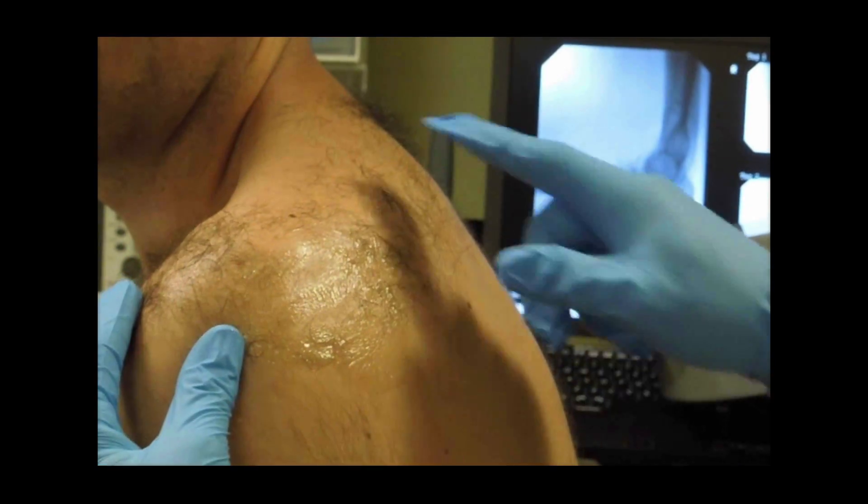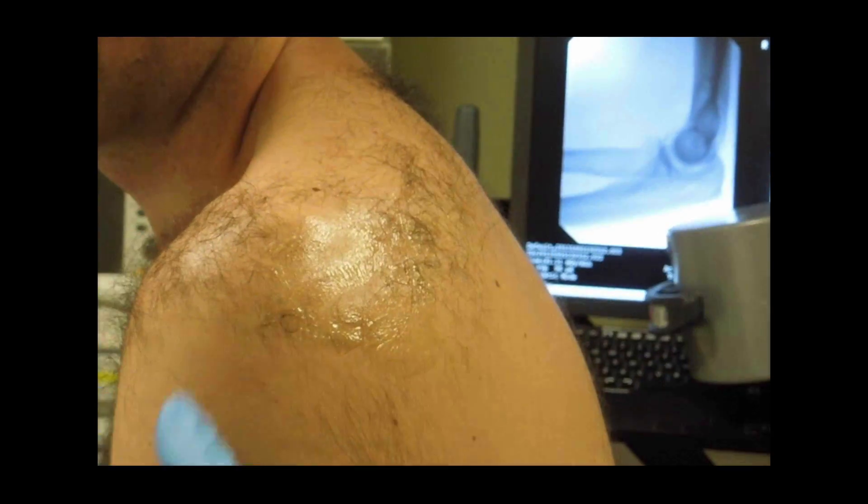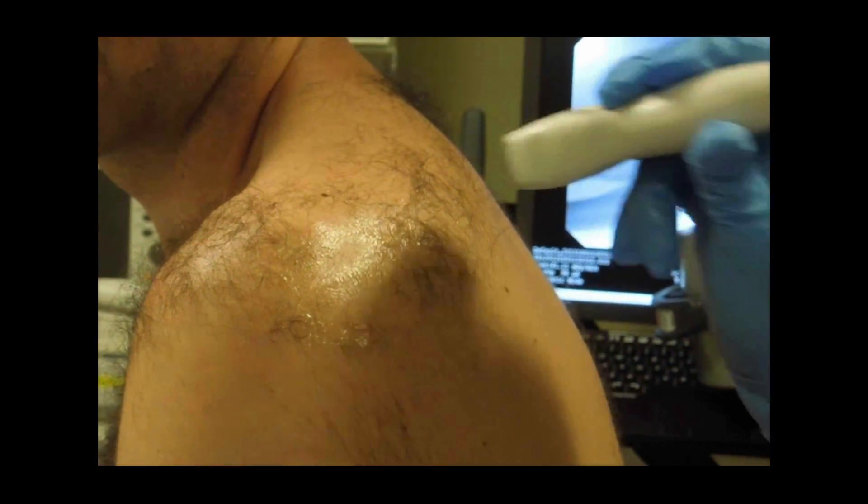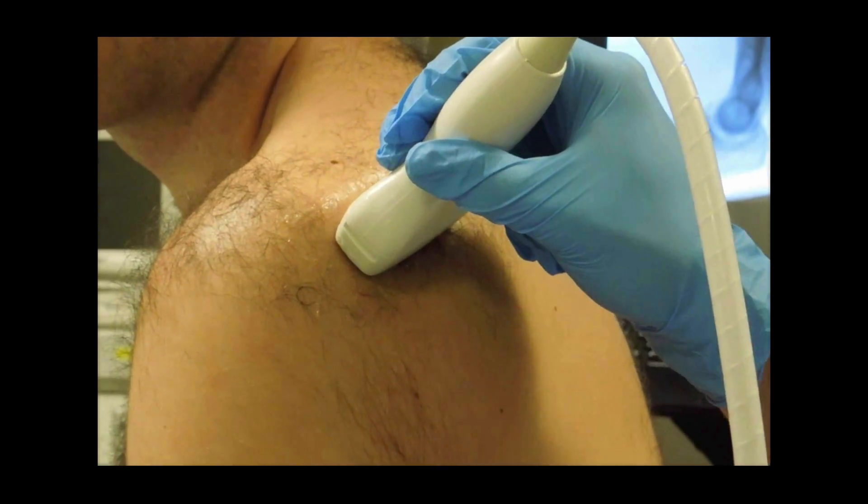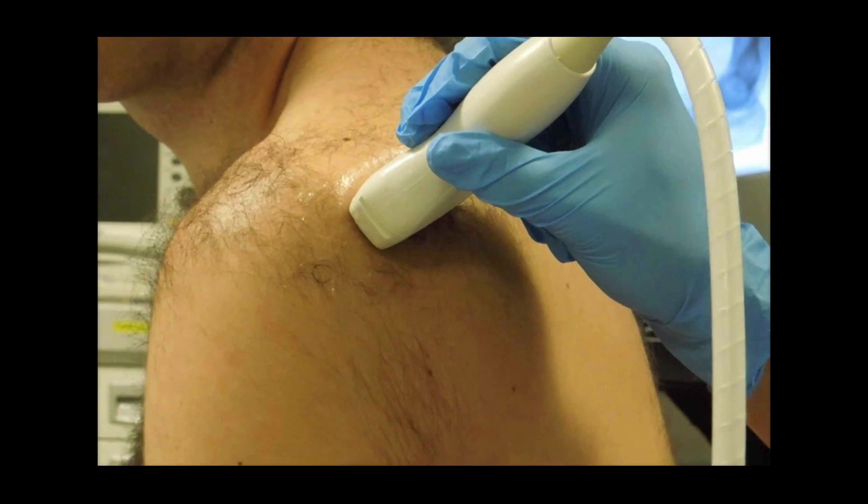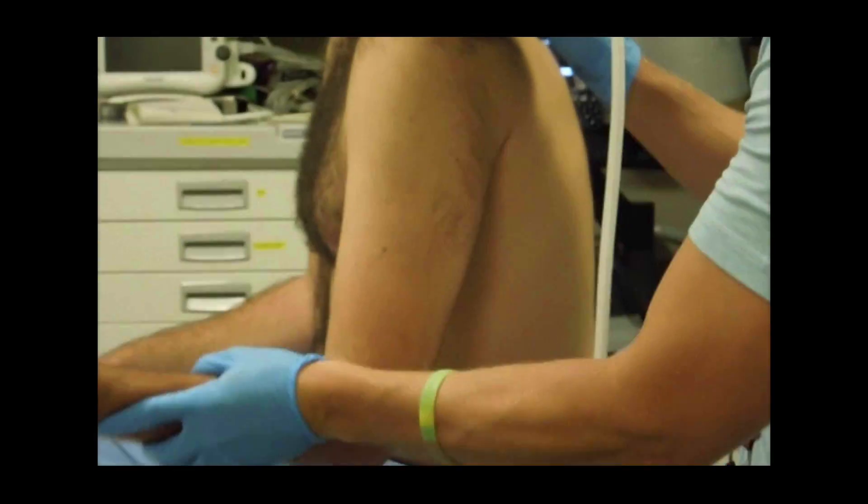Quickly, let's watch this again as it's really important. Scapular spine, probe on the spine, slide just a bit downward, and then if you can, if the patient lets you, subtle little movements, not likely this vigorous but subtle little movements in and out of their arm.